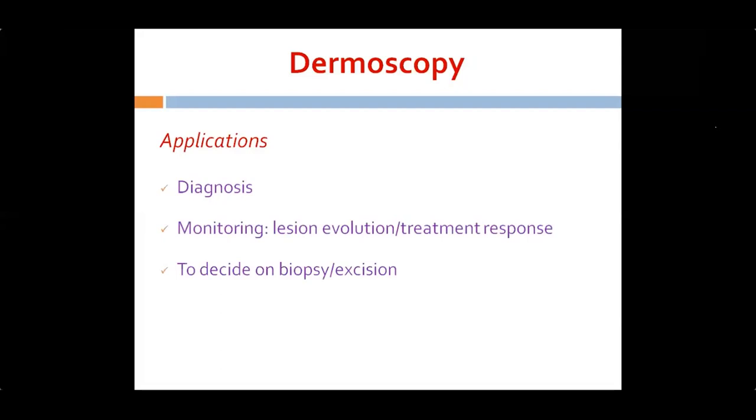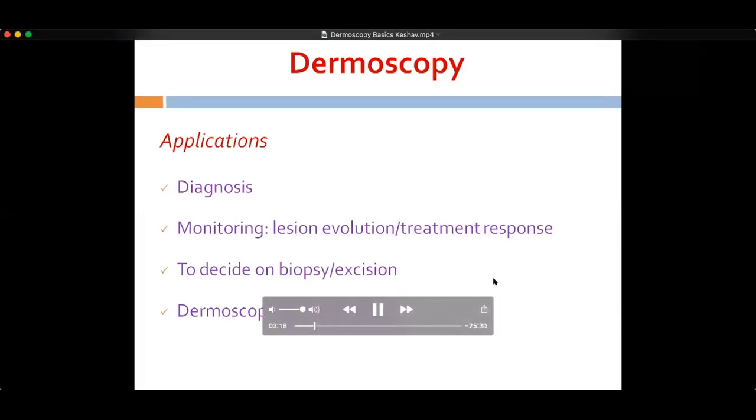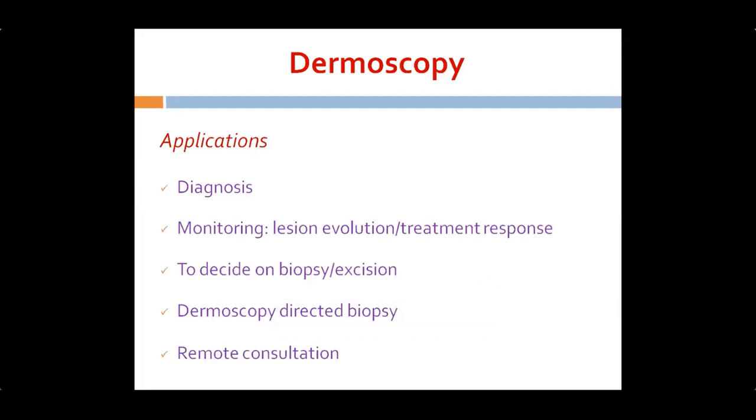Or conversely, it may also let you continue monitoring the lesion and prevent unnecessary biopsy or excision of the lesions as well. And this is also another important application, especially when we are dealing with larger lesions. Dermoscopy can help you locate precisely a particular area of the lesion, which can give high diagnostic yield on biopsy. So dermoscopy-directed biopsy is routinely practiced nowadays so as to increase the fruitfulness of biopsy, which is an invasive procedure and we cannot do it repeatedly. Then, as it is a digital imaging technique, the digital images can be shared at different portals with experts located at remote places for consultation, learning, and knowledge sharing as well.